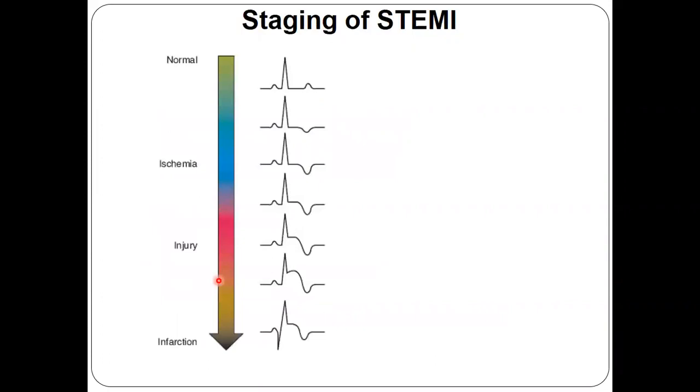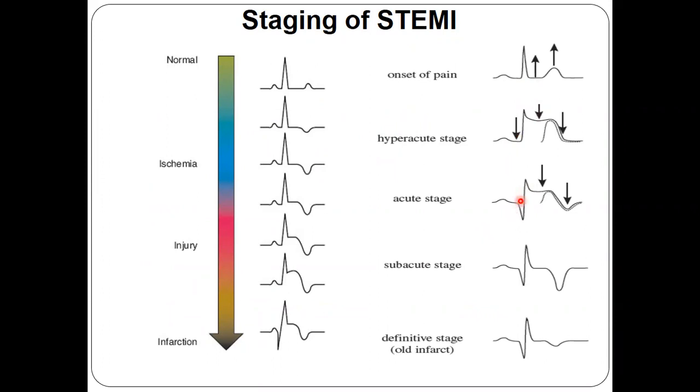First, when we have the onset of the pain, usually the ST segment and the T wave are elevated. So this is called a dome-shaped ST elevation. And when the acute stage is starting, it means that the sign of necrosis is occurring immediately. And of course, meanwhile, the ST elevation goes a little bit backward, but the T wave starts to develop, turning to the negative one. And the lesion, the ST elevation, is, let's say, clinical death, because the cells cannot tolerate forever that they cannot maintain the normal membrane potential, and slowly those cells will die, or by restoring the circulation, through ischemia it will heal.